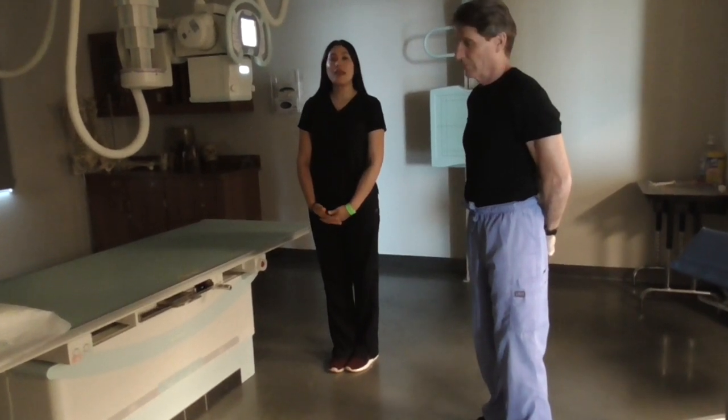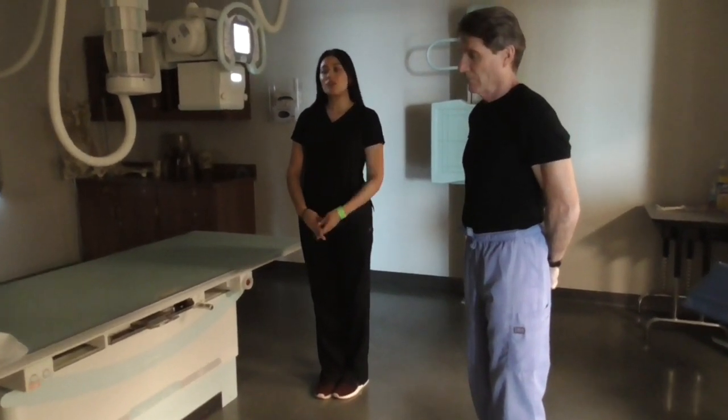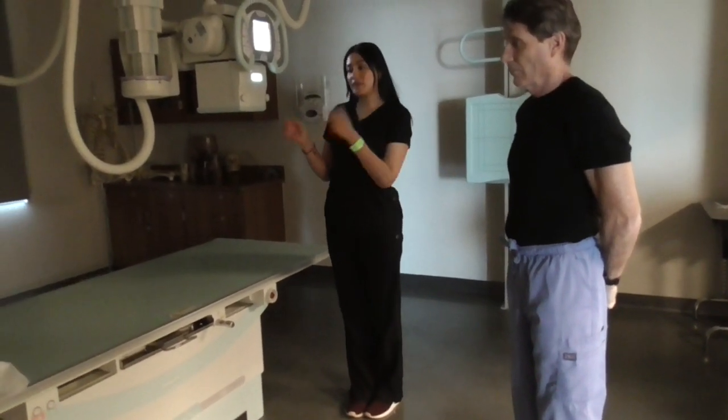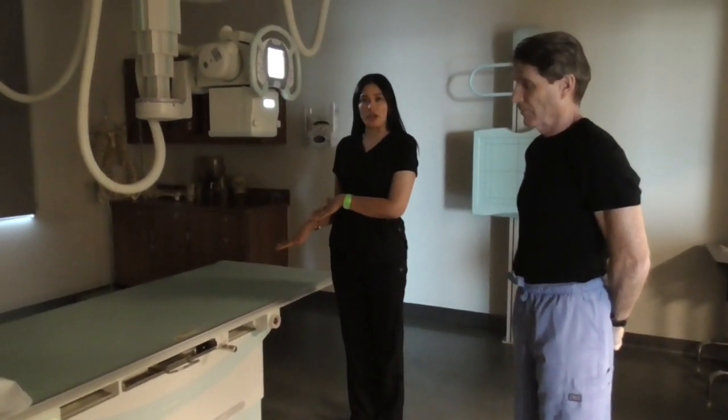We will now be demonstrating an AP chest. We can do it supine or we can do it at the wall bucky. I will be demonstrating the AP supine chest.